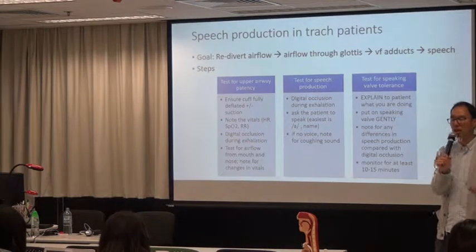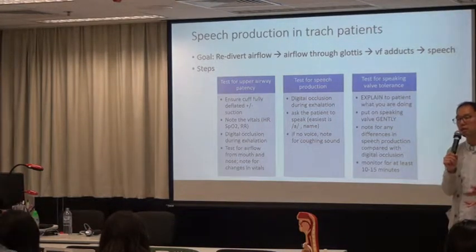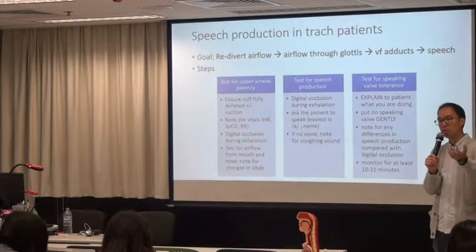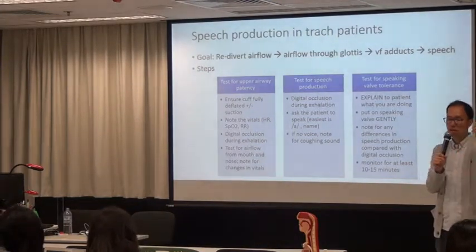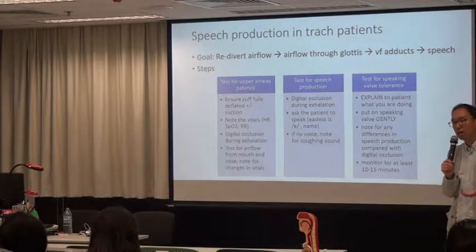Okay, you get scolded by the nurses. Don't do that. Okay, monitor for at least 10 or 15 minutes because sometimes these patients have problems managing their secretions. Okay, after putting it on, they have deep breathing difficulties, their respiratory rate becomes much more rapid.